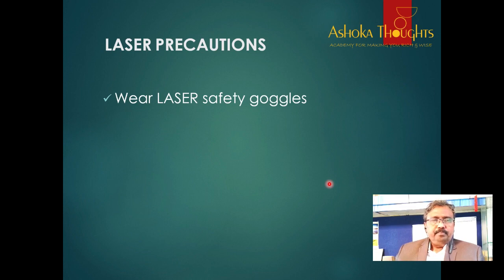Opaque goggles are also provided for patients, and when you are operating on the patient, these goggles are mandatory so that the laser beam does not go into the retina and permanent eye damage can be avoided.